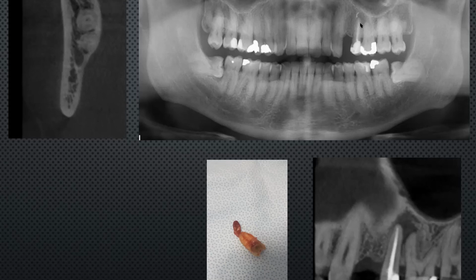and certainly it's less painful afterwards. It's sort of a reconstructive thing. You're placing something, so it's definitely not that big of a deal. I say to patients, there's going to be a lot of opening and closing. I'll be drilling, stop, check, put my direction indicator in, check the position of the implant, check against the opposing dentition. I warn the patient of that, and they're very grateful that you're taking your time to make sure the position is perfect. That's really important.